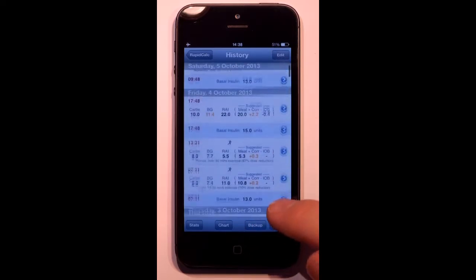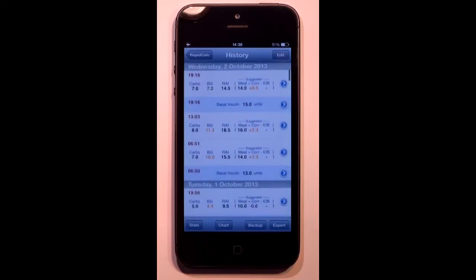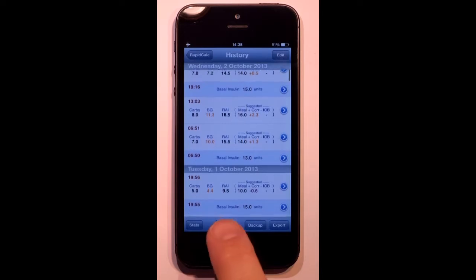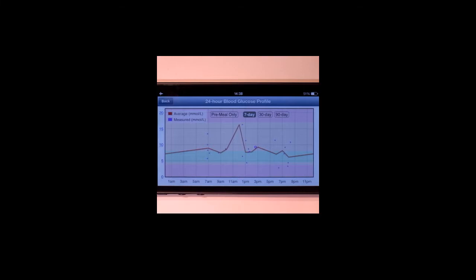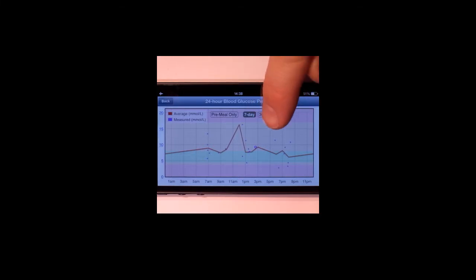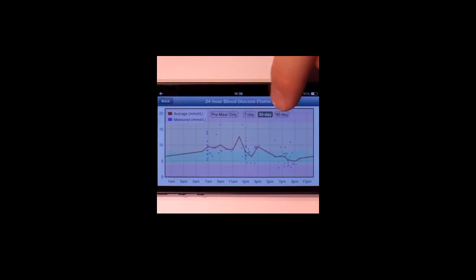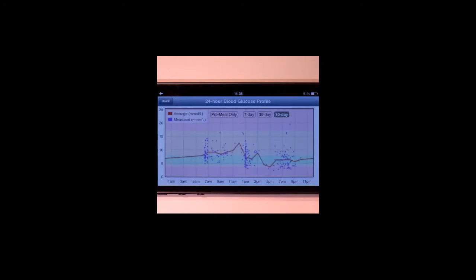RapidCalc keeps 90 days of history for me. The chart view shows me my blood glucose profile over the course of a day, using data from 7, 30 days, or 90 days worth of history. And it helps me to spot trends in my blood glucose readings.